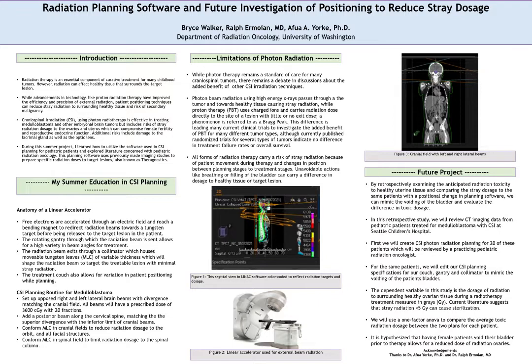It's based around a machine called a linear accelerator, which will send free electrons through an electric field. They'll be bent by a magnet. Before reaching the patient, all these high energy electrons will encounter a multi-leaf collimator, which is like an adjustable tungsten aperture, and that helps shape the beam in a number of different formations before it reaches the patient. We can also move the couch. We can rotate this large gantry, and that gives you a number of different positions for treatment. You can position the patient on the couch, and this gantry can come at a number of angles to the patient.